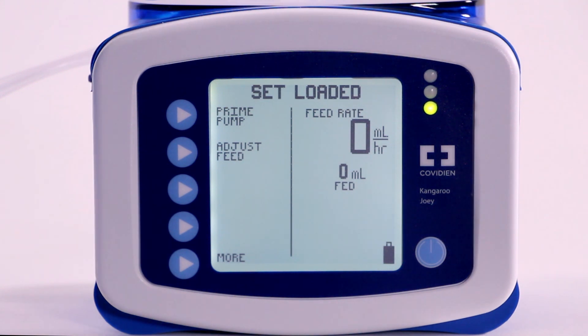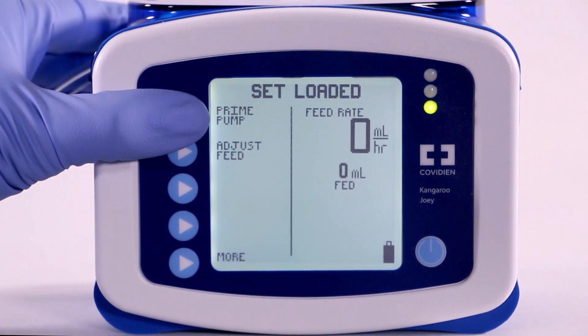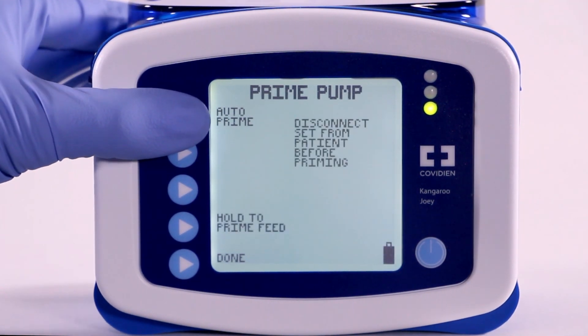Begin by pressing Prime Pump from the opening menu. You now have the option to prime the pump automatically by using AutoPrime, or manually by pressing Hold to Prime. The pump reminds you to disconnect the set from the patient before priming.